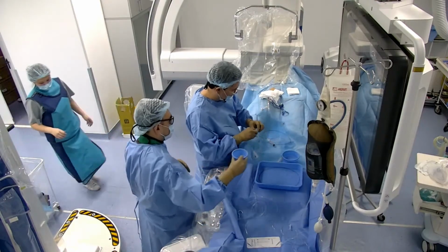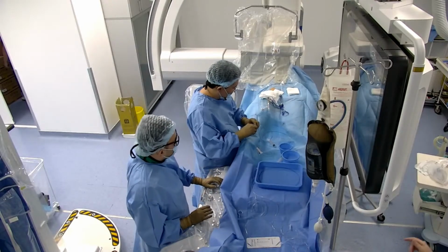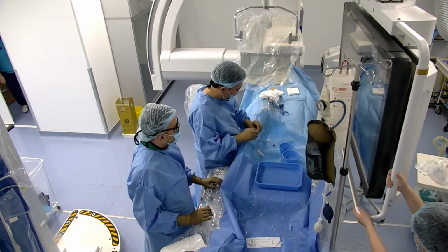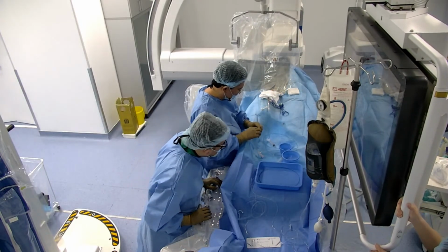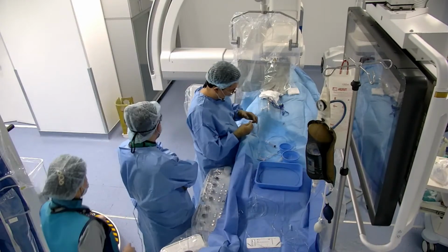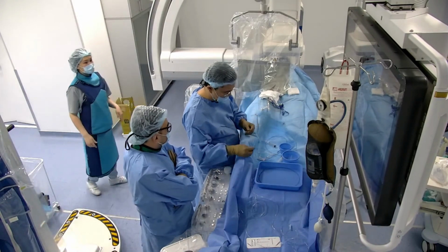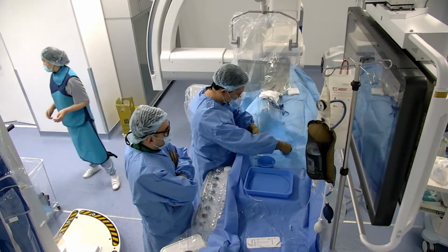The same things all the time. I need to repeat, as I'm coming from time to time. That's why it's not so regular, and I need to say the tray should be here, the water is here, contrast is here.